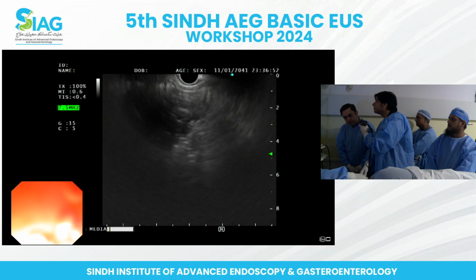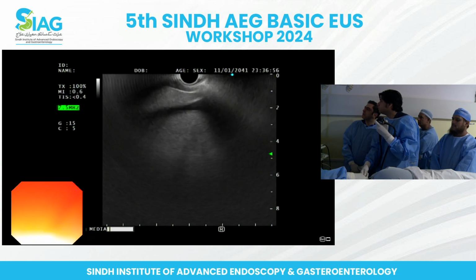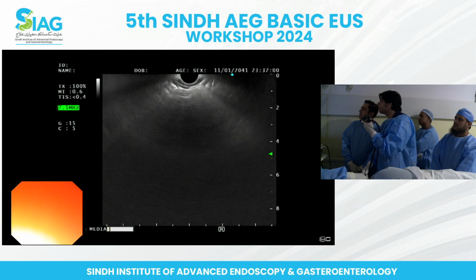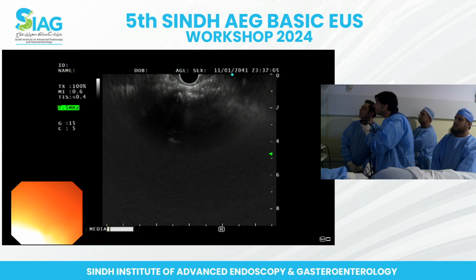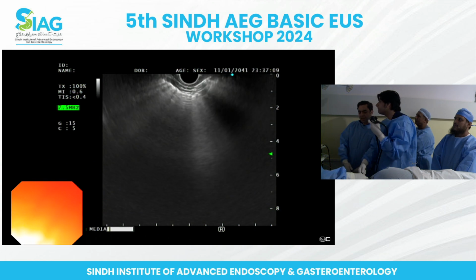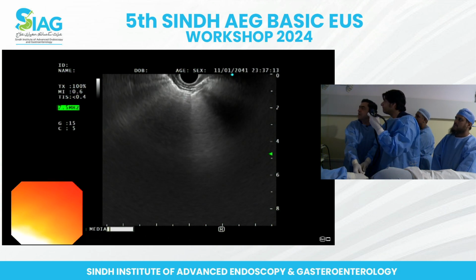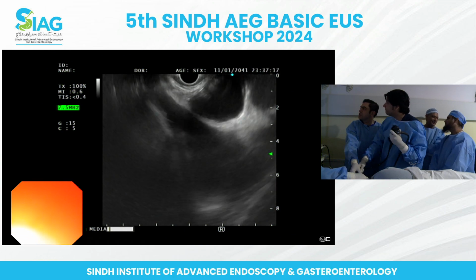So at what level are you? I think you may need to just pull back slightly. Yeah, excellent. Okay, apply suction there. Okay, keep on going. So use it dynamically, freely you can use, just use it dynamically on this side and then on the other side, so that you're just trying to find.